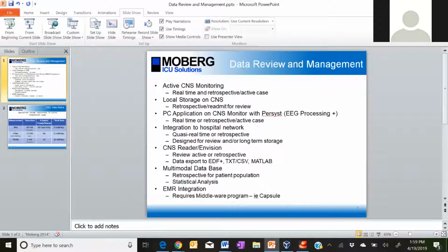And so even if these things are not in your daily workflow now, knowing that you've stored the files, these are all things that you can always do later. So whether it's for teaching or in a case example, or really truly going back and doing a deep dive into some sort of quality improvement project or some other IRB approved project where you're looking at specific markers, this data that you have can really be helpful. Absolutely. Yeah, I think that's great.